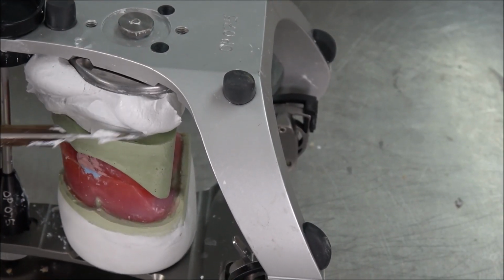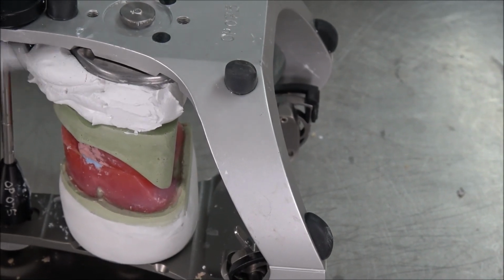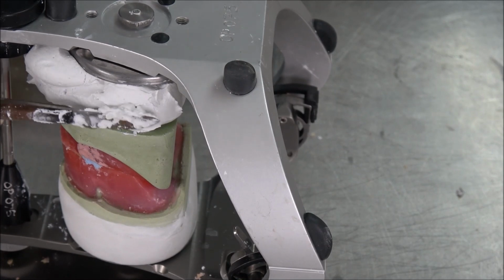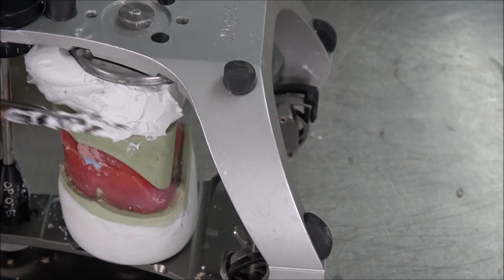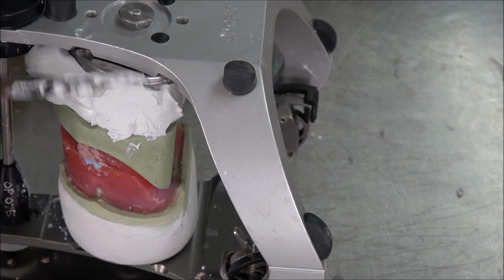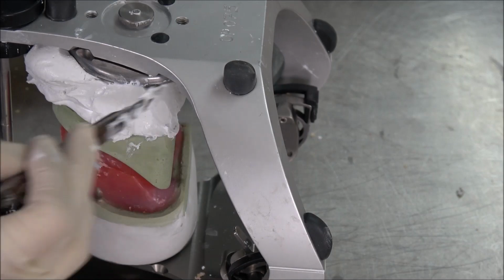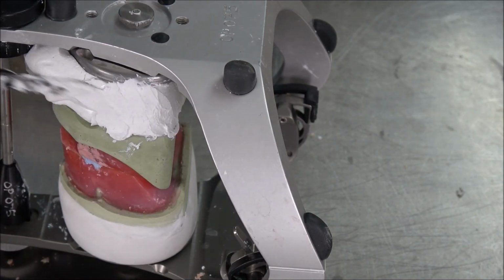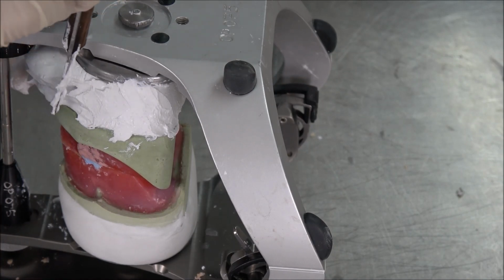Okay, can you see here? There's a little bit of a hole here. Never mind, you just add it. If you don't have time to add it, never mind, it's okay. So you just leave it. Later on, I will show you how to add on to fill up all the holes. So right now you just roughly remove the excess part. That's all.